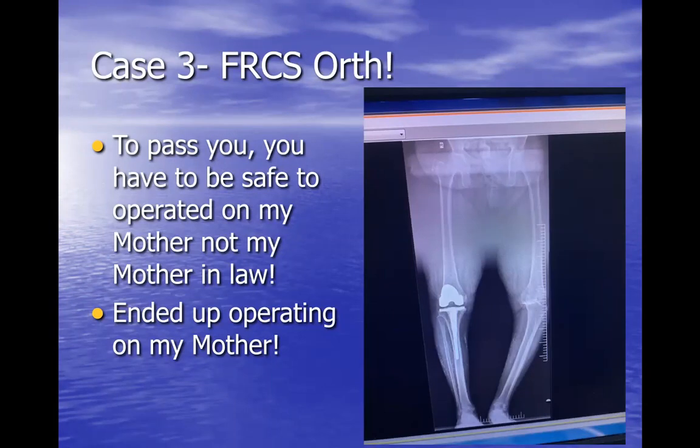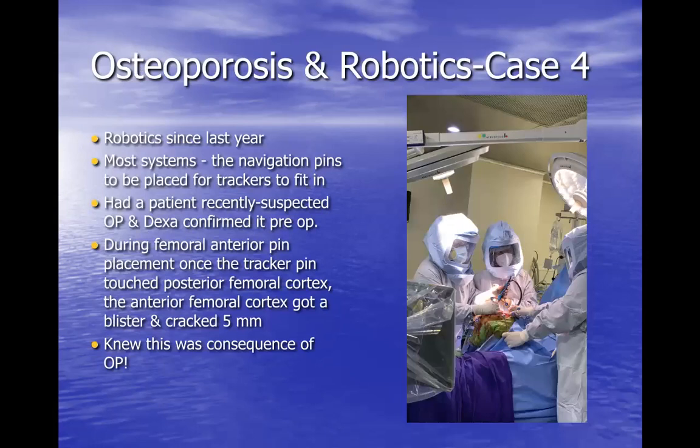And then when we started, he said, sir, you are senior yourself, so why don't you start? And then, as the anesthetist was saying, I started. I hesitated for 5 minutes. And after 5 minutes, I was so much involved in surgery, I completely forgot that it was my mother. And she had osteoporosis. And you could see on the tibial side, I had to use a stem extender and cement the metaphyseal region. So she's awaiting the other side in the next few months.